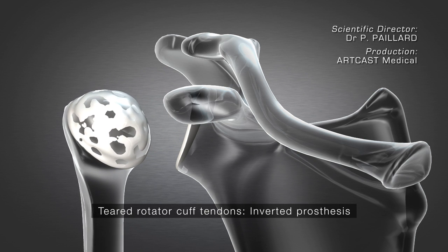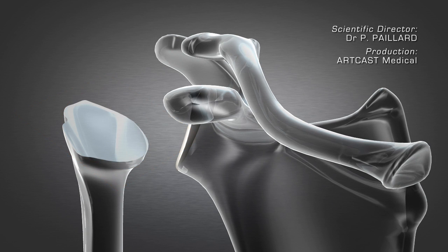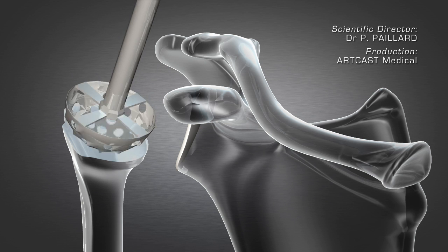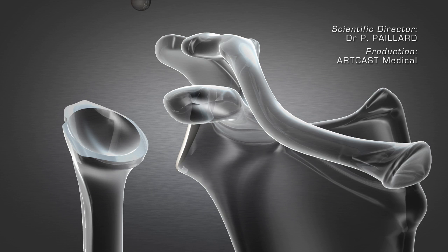The same surgical approach is used. The humeral head is cut, and then the bone is prepared with rasps to allow the placement of the socket-shaped humeral component.